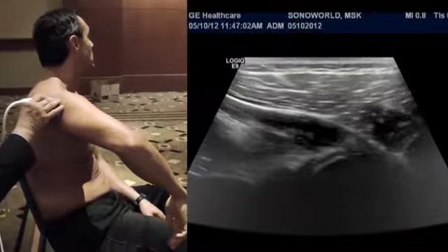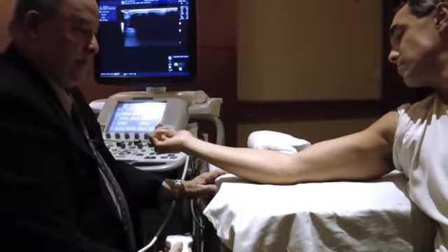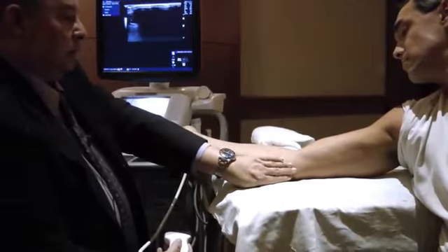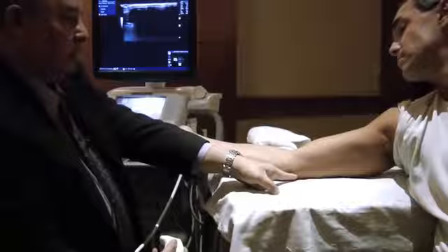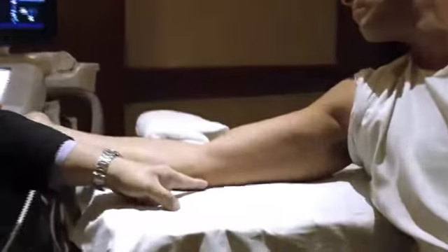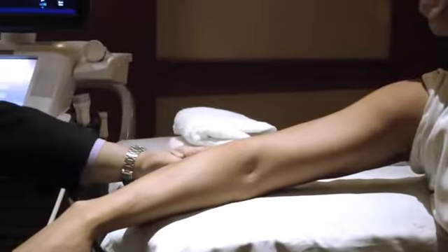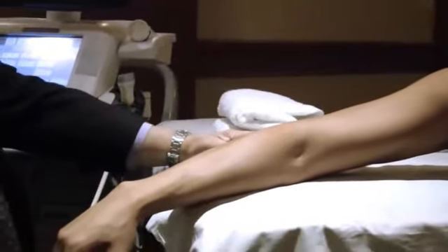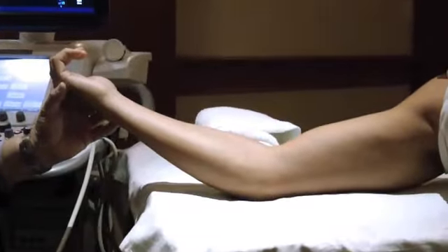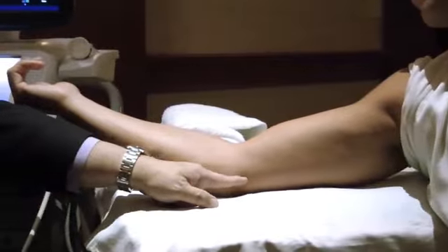The dynamic exploration of the elbow will entail, again, probably looking at it in four-quadrant display. But it's only in the anterior quadrant, the ulnar quadrant or the medial quadrant, and the posterior quadrant where we'll be looking for changes that may occur around the elbow. Many times, if it's a bit more dedicated, then the fourth quadrant, which is going to be the radial quadrant, is also going to be explored for radial collateral ligament tears. So on the basic exploration of the elbow, what is most important now is to identify the medial collateral ligament.